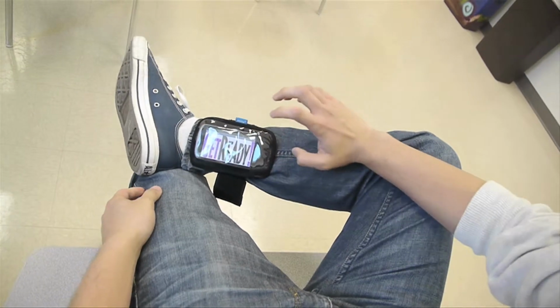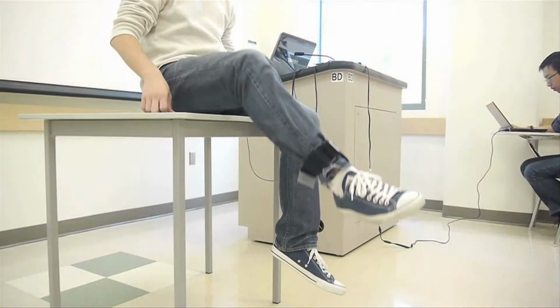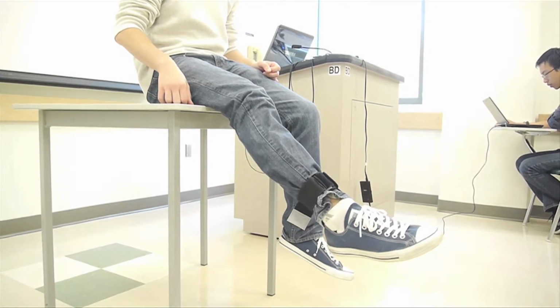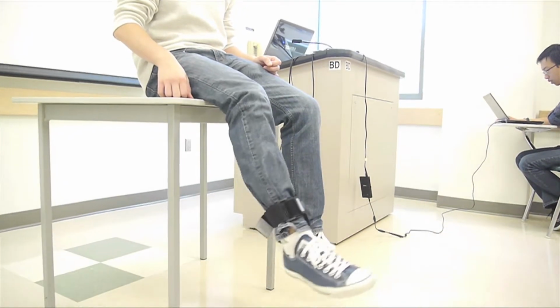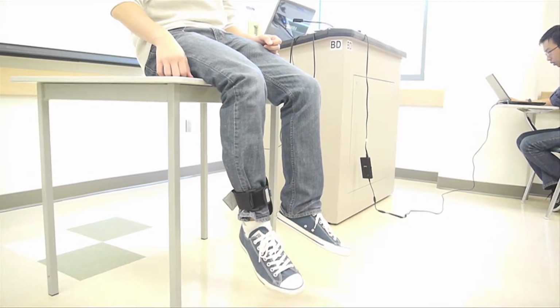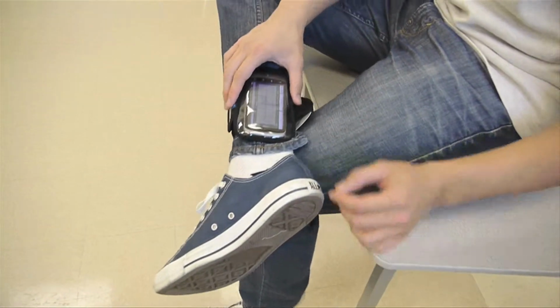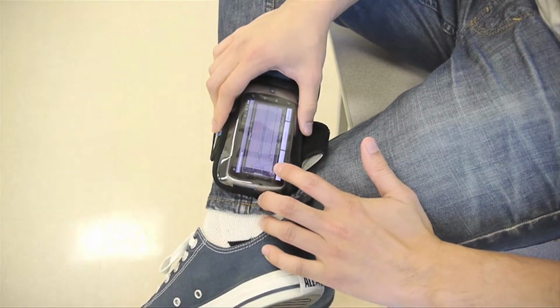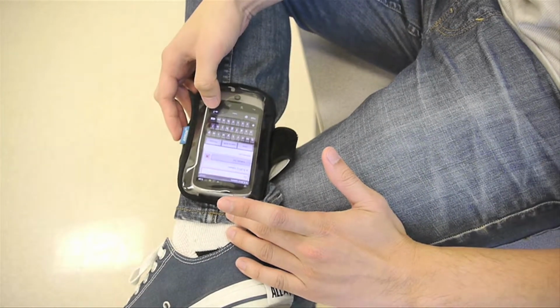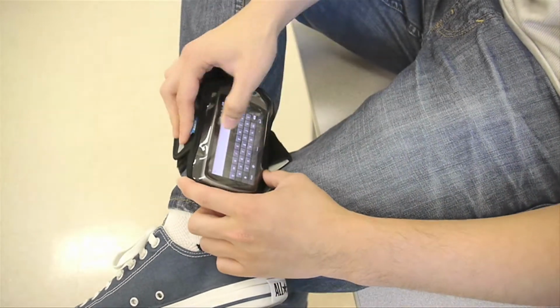The start button is pushed. Then the client raises his or her leg. After the initializing sound is signaled, the leg is released, and the phone starts recording. After recording, the data can either be saved or the test can be repeated. The saved data can also be sent via email.